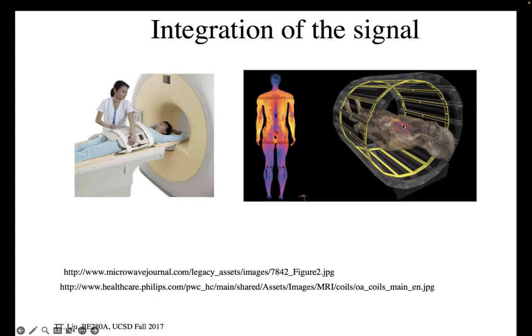And we can get it rotating at 64 megahertz by programming the current in these elements such that they're phase delayed. And you have these currents running around with this phase delay of 64 megahertz, and then the magnetic field rotates around. So that's one way to think of the transmitted radio frequency energy by this coil, which is called the transmit coil. That gives you a very uniform transmission field across the patient, which is good. And so we can generate a signal from the entire volume.